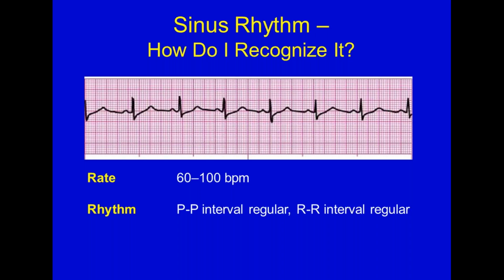You guys got calipers yesterday, so did you get to play with them at all and use them on anything? No, you just got them? Okay, today we'll get to use them. Hopefully you have them.